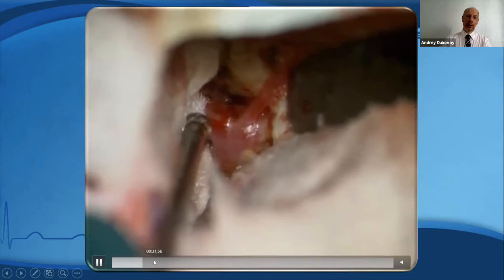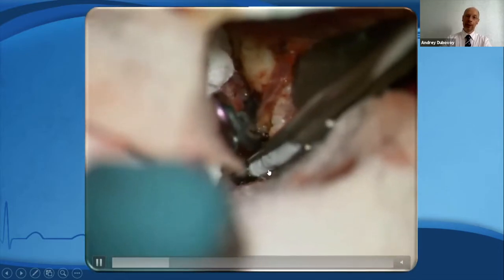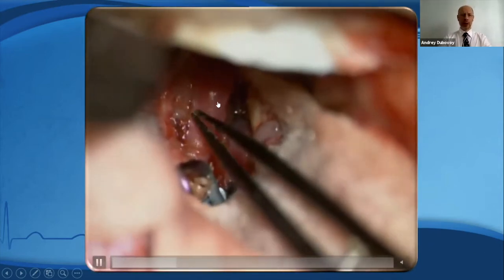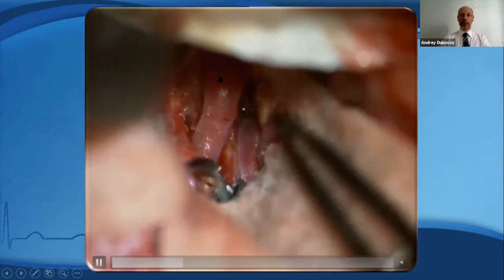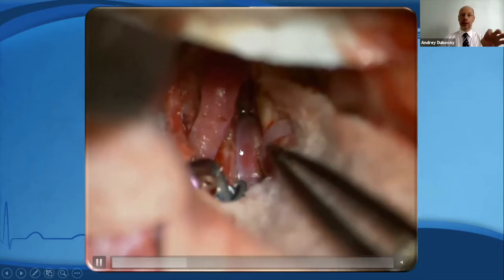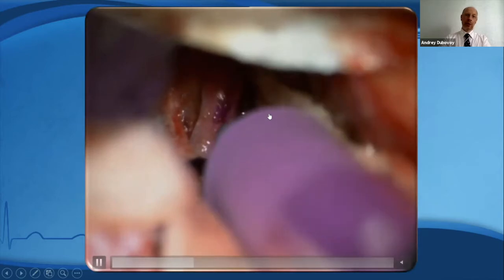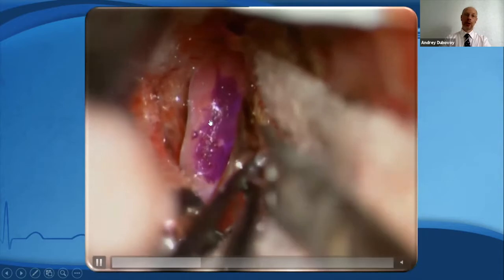I tried clipping this aneurysm along the pericallosal artery, but this type of clipping compromised the blood flow inside the callosomarginal artery. Checking the blood flow through the pericallosal artery, I saw the left pericallosal artery running just superiorly. And I decided to reimplant the callosomarginal artery from the right side to the left pericallosal artery.